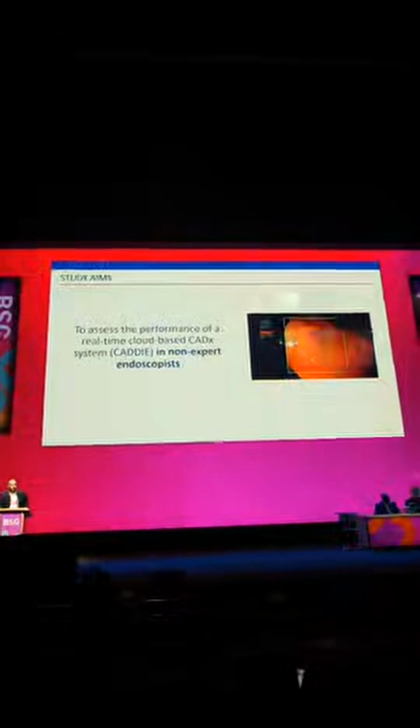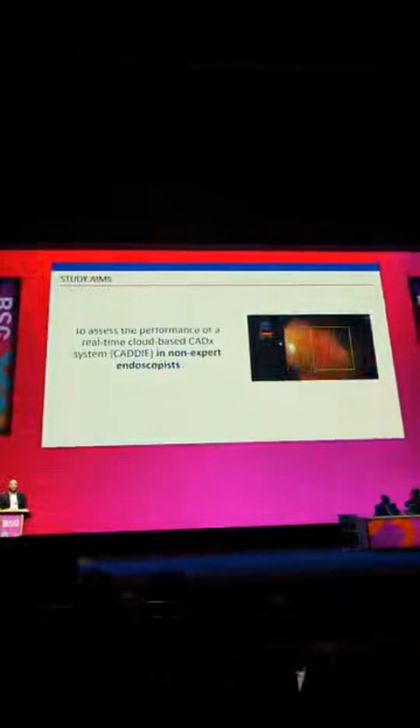The aim of this RCT was to evaluate the CADe function, but a secondary outcome was to evaluate CADx. And it's a really important study in my eyes because it's the only RCT that's been done in non-expert endoscopists. So the use case for CADx has always been to improve the performance of our non-expert endoscopists and raise their optical diagnosis accuracy. And we've actually only ever had one other RCT in CADx, so it's pretty novel stuff.